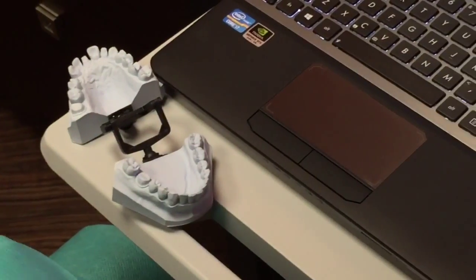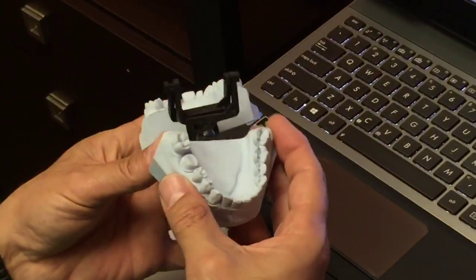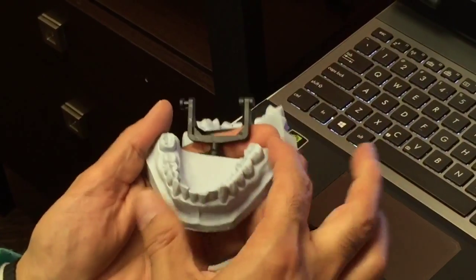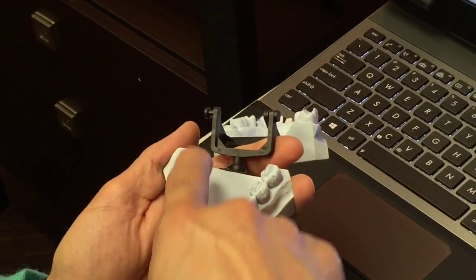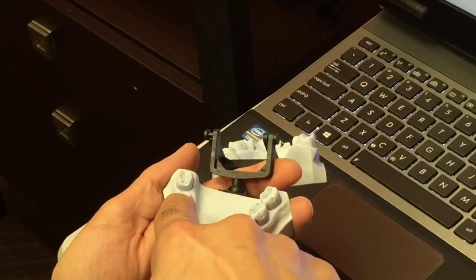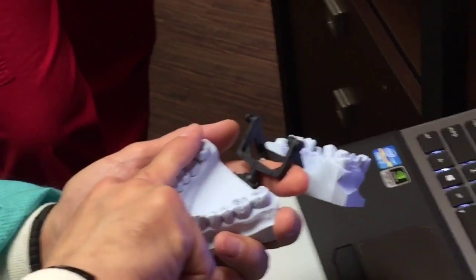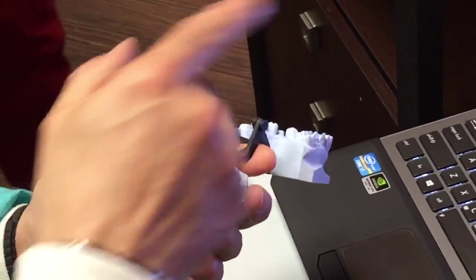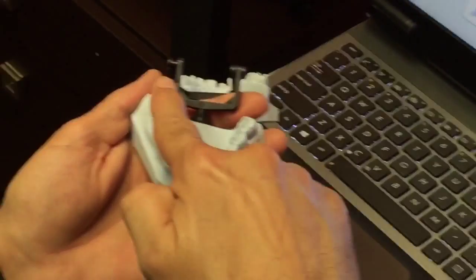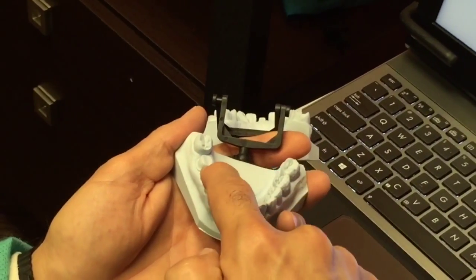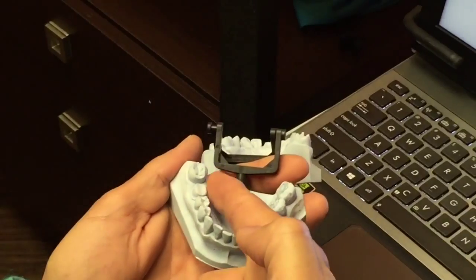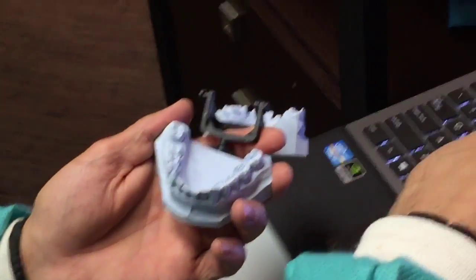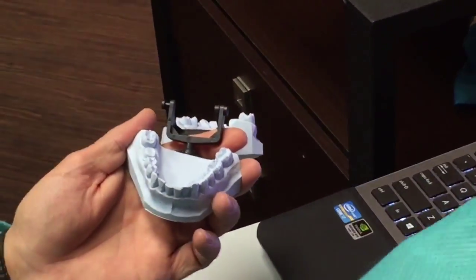You always scan the prep, the opposing teeth that come over these three. When you're scanning the prep, you put your scanner on the top. You come from 31 to 29. You start from the occlusal surface. Then you tilt it. You have to capture, what it is, it's a digital imaging. So you press your scanner on the top, scan, scan, scan. When you come to 29, then you roll over. You get the lingual, roll over, get the buccal.